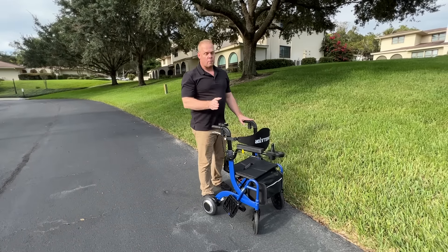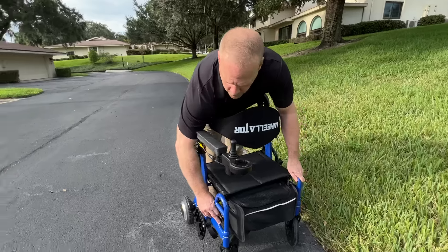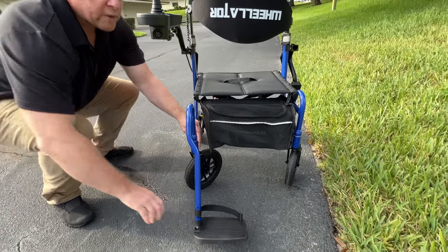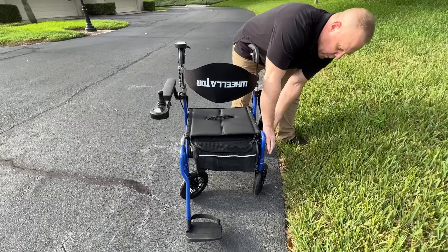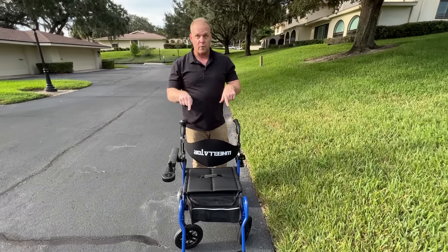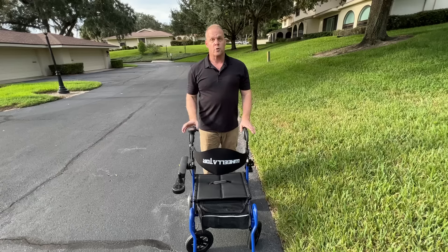There are a few things that make this completely and totally unique, unlike anything else, unlike anything on the market. You might notice that it has some leg rests here, right on the side — with a flip-up footrest. So I guess you're probably guessing where we're going here with this. And we have bigger front wheels. We're going to do a lot more videos about this. This one is just going to describe the utility. I'm going to show you how this works — we're going to go down a hill and use this in a way that a lot of people wish a regular rollator would work.